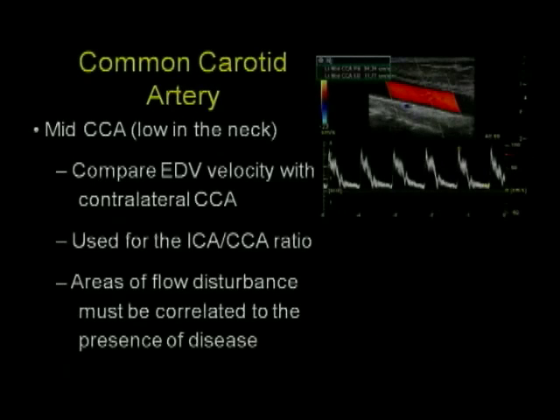significant proximal disease. The examination is then carried on through from the proximal common carotid artery up to the mid common carotid artery in the mid to low neck. Keep in mind that this does not mean that you should just pick up the transducer and drop it in the middle of the neck.